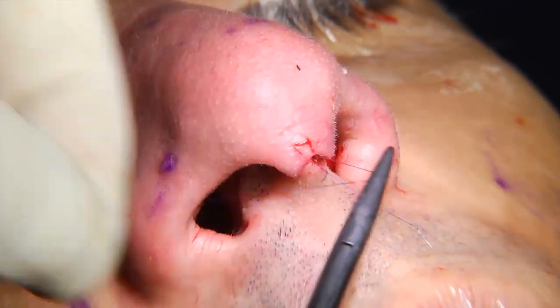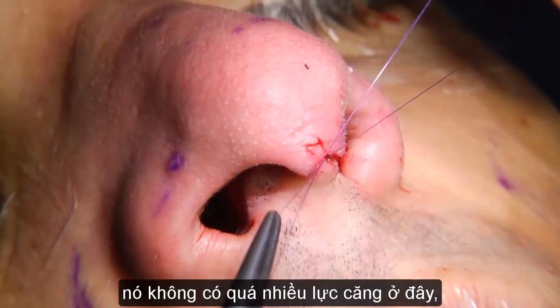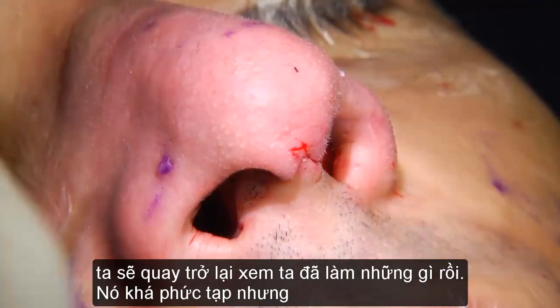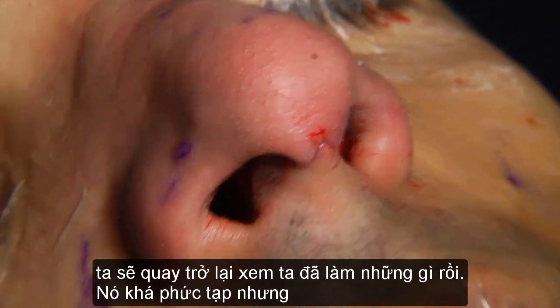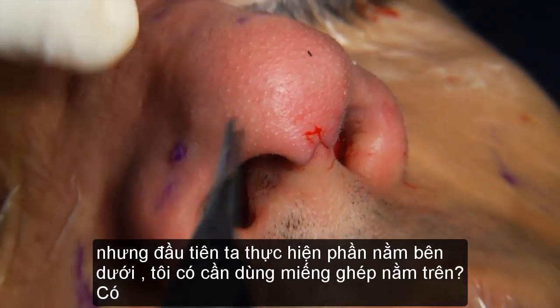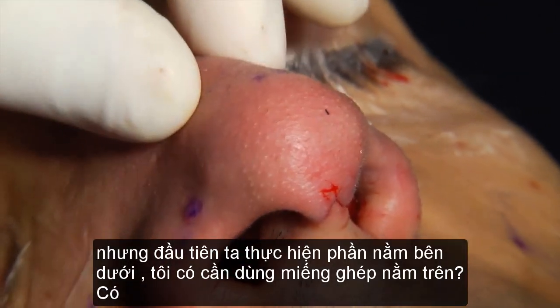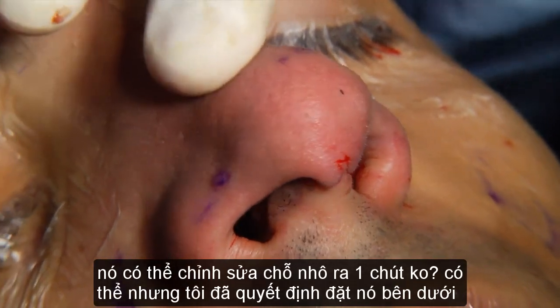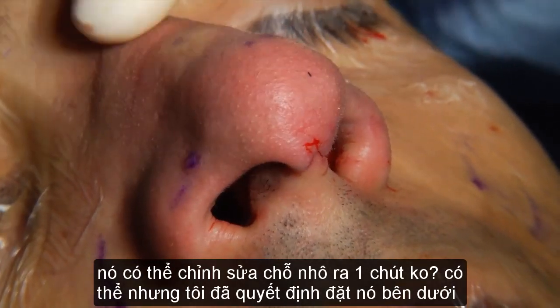So, there's not much tension here, it's just a little. So let's get back to what we did. It's kind of complicated, but first we did the underlay, like this. Could I have done an onlay? Yes. Could that have corrected my convexity a little more?